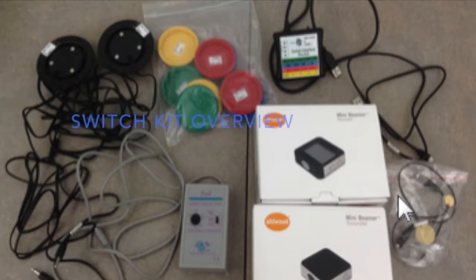I'm Mike Trevethan, a speech therapist with Keystone AEA, and I'm also a member of the Assistive Technology team. This video is to demonstrate the switches that are available in the switch kits that can be checked out from each sector office. The Bluetooth is a Bluetooth switch that can be used to send switch commands to your iPad in order to control apps.